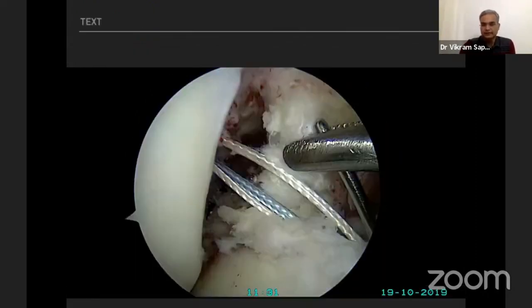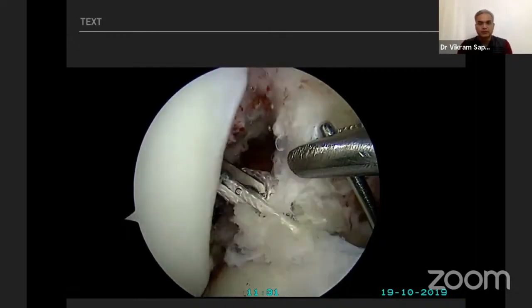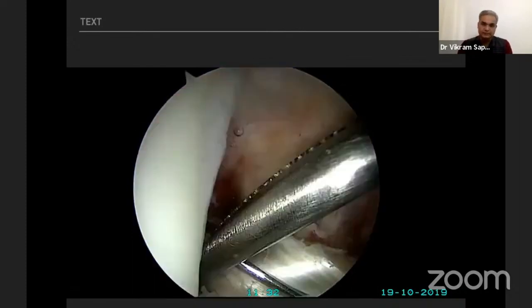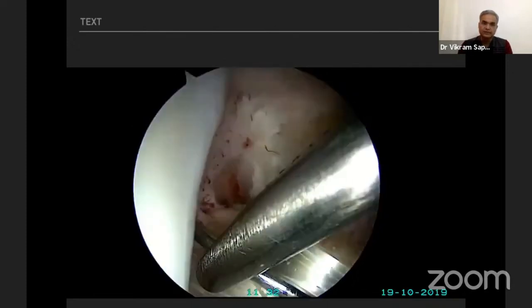Once the tibial tunnel is made, my preferred fixation on the tibial side is a bio-interference screw. I prefer to place the guide wire before inserting the graft, with the preferred position of the guide wire being posterior and lateral. The guide wire is placed first, then the graft is passed.